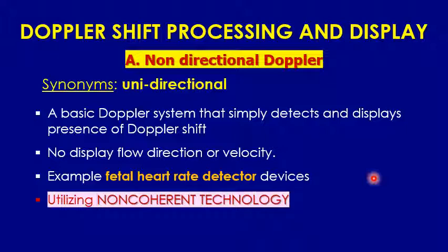Before closing the wound, if they hear sound coming out from the device wrapped around the patient's ankle, it means that the flow is successful, and they get the leg revascularized. Based on what? Based on this non-coherent technology device wrapped around the patient's ankle. So this device is also used to detect the flow. There is only flow or there is no flow.